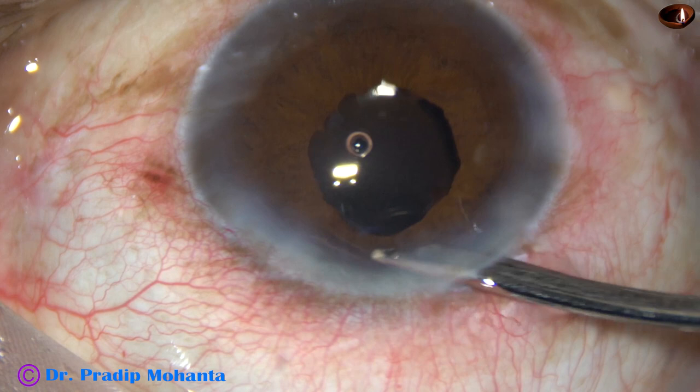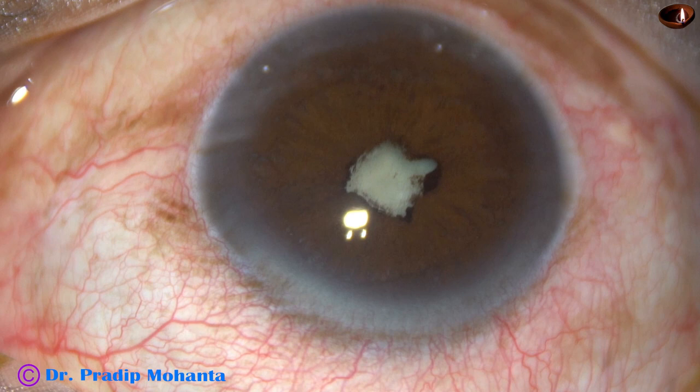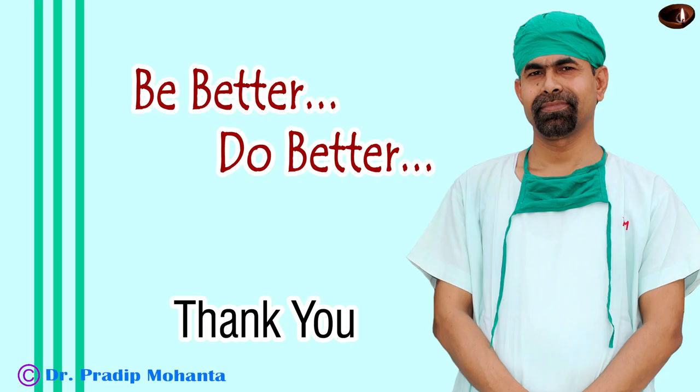So we started our journey from here — almost 360-degree posterior synechia — and we have reached this point. This is the beauty of surgery. Thank you very much for your attention. Hope this video will inspire you to take on challenging cases, improve your surgical skills to great heights, and serve mankind with love, respect, compassion, empathy, and great surgical competence.